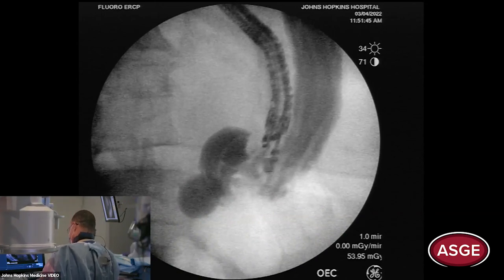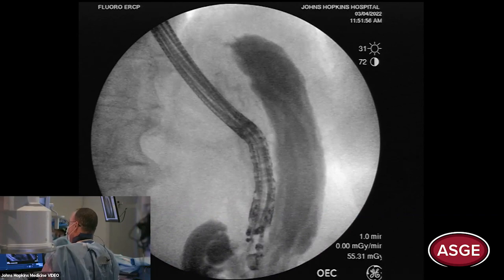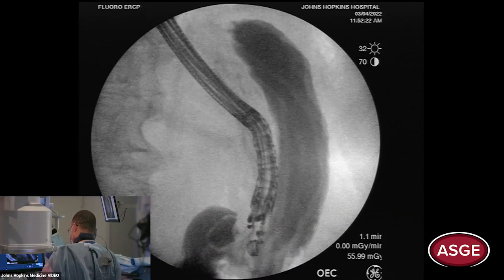We're using a 50% diluted contrast and saline mix, injecting through a pump through the 19-gauge needle, filling the stomach. Once we like it, we pull the scope back a little bit and fluoroscopically point toward the gastric body, then place a 20-millimeter AXIOS. It doesn't matter where you puncture right now because you're going to fill the entire stomach and then decide where the optimal place for the AXIOS is.